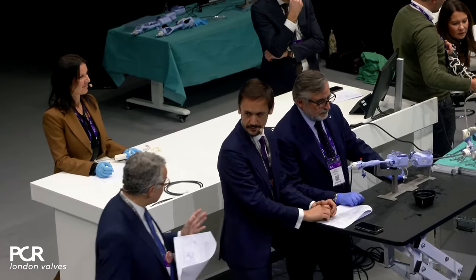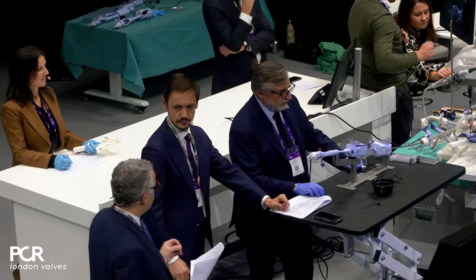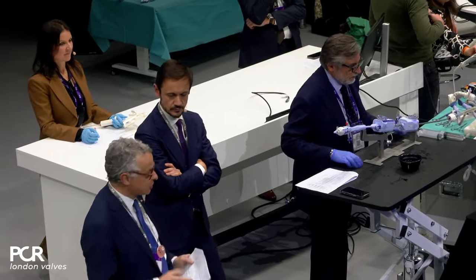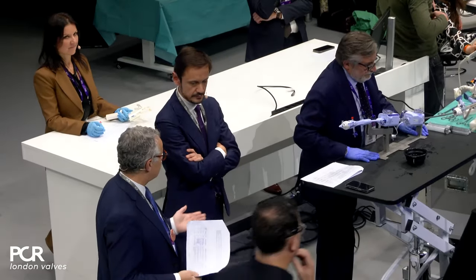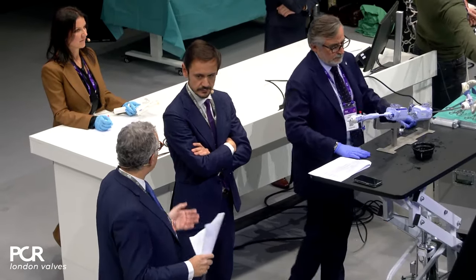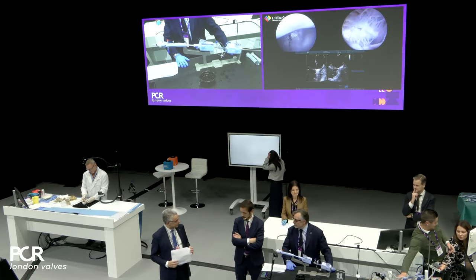So we have seen the case. It's a case where the TR comes probably from this trauma. There was probably a small rupture of the corda, and the TR is anteroseptal. So show us how you would perform this procedure.